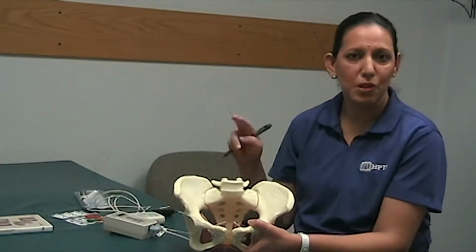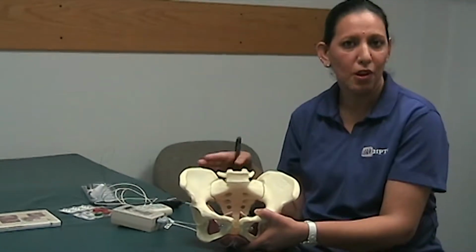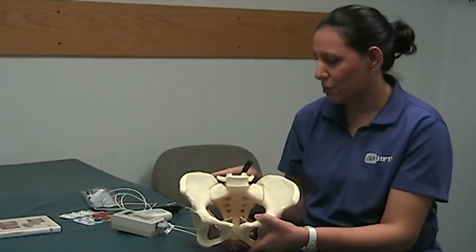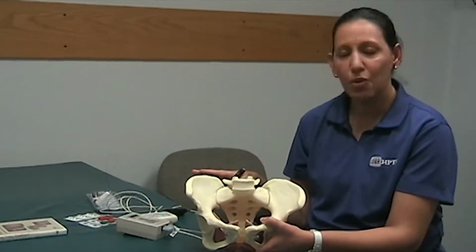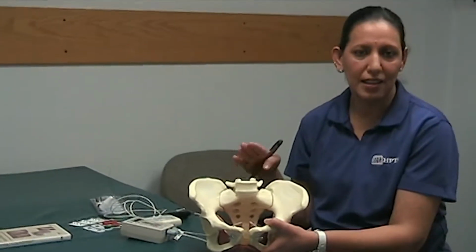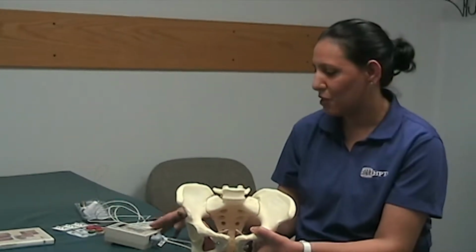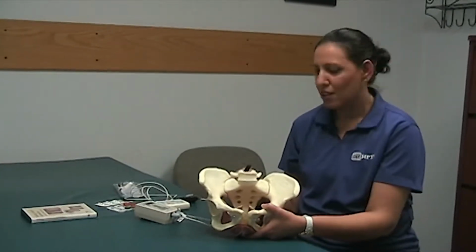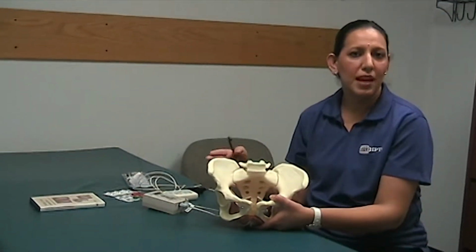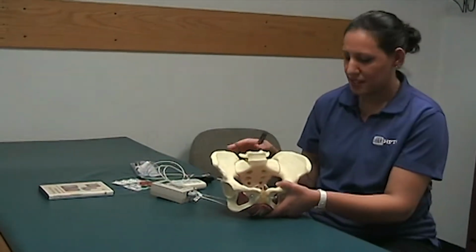So they could do slow contractions, in which we do different application protocols that are inbuilt into the software computer system. We use long contractions and relaxation in that. We do 10-second holds and 10-second relax, and that goes on for a few minutes and 20 or 30 repetitions. And then we do fast ones, which are 2-second work and 4-second relax. So we try these different types of protocols to strengthen the pelvic floor in both ways.